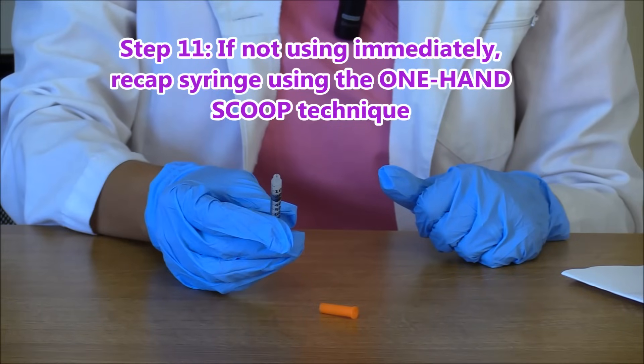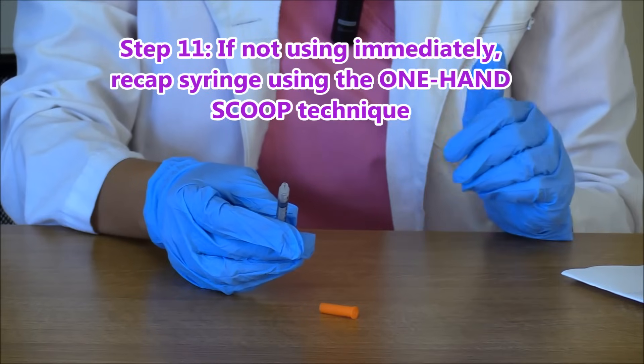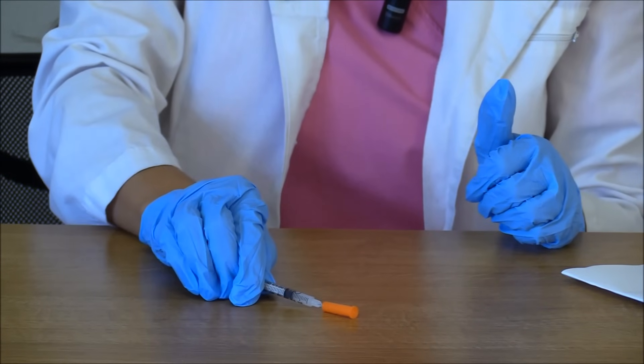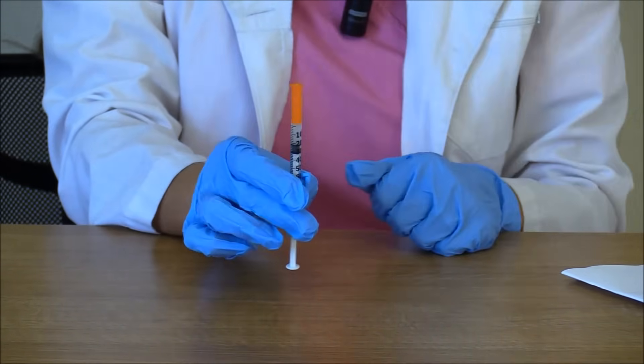After you draw it up, if you're not going to give it immediately, to prevent contamination, sticking yourself, or sticking someone else, use the one-hand scoop technique. Just take the cap and scoop it up, and then you are ready to go.